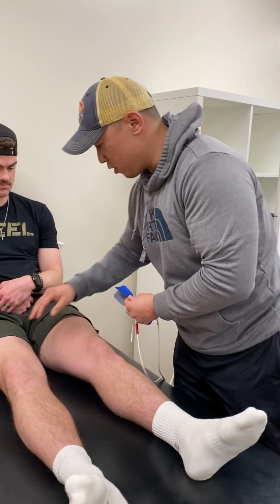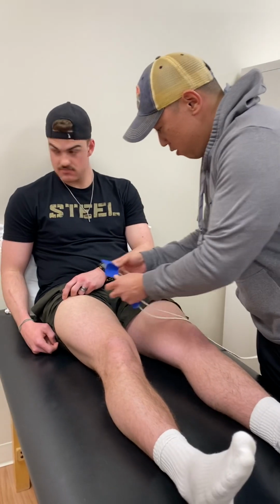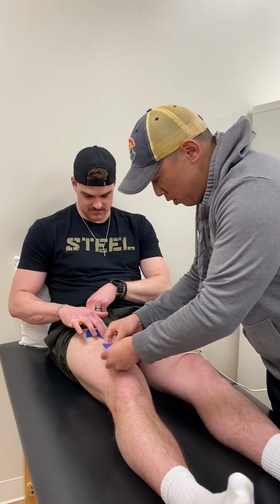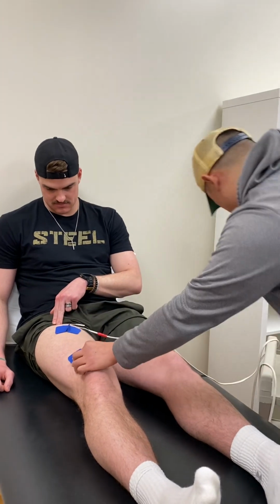All right, so I'm going to put this on. Sorry, it's a right quad. So no impairments or anything. All right, everything feels good. I'm going to put this on top right here, and then the other one I'm going to put closer to his patella. All right, perfect.